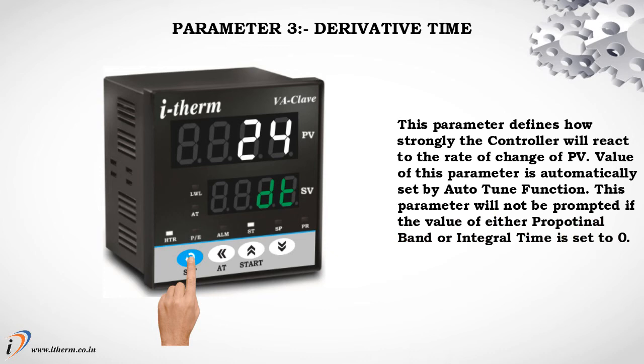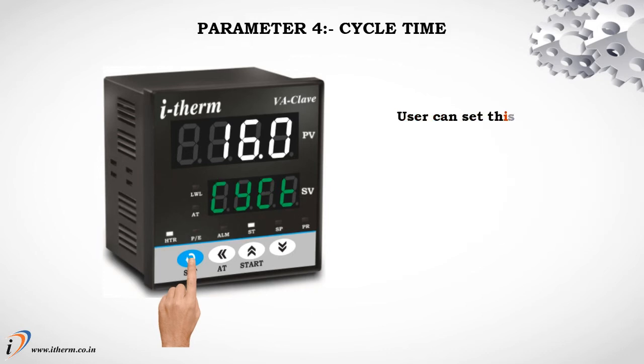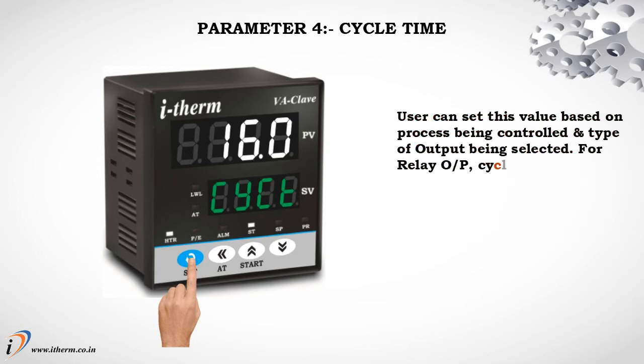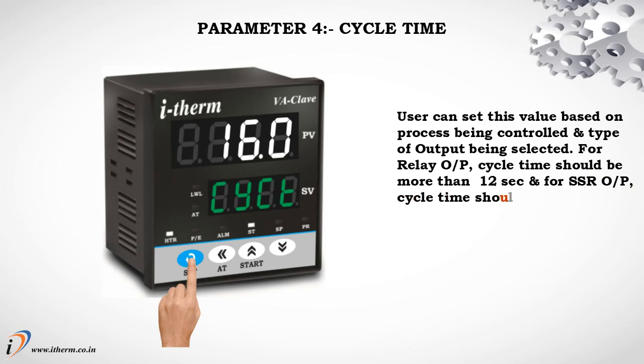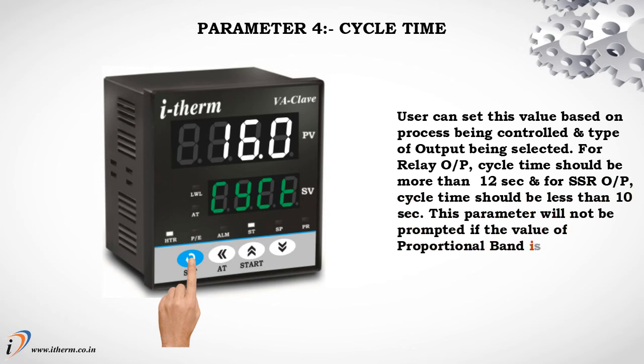Parameter 4: Cycle Time. The user can set this value based on the process being controlled and the type of output being selected. For relay output, cycle time should be more than 12 seconds. For SSR output, cycle time should be less than 10 seconds. This parameter will not be prompted if the value of proportional band is set to 0.